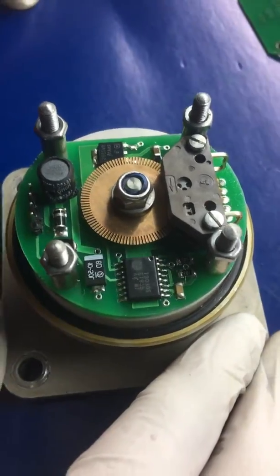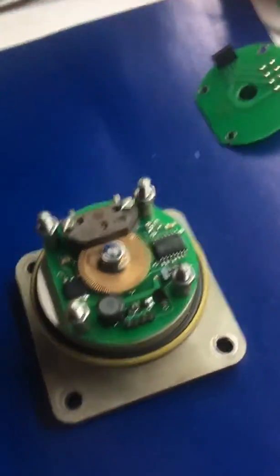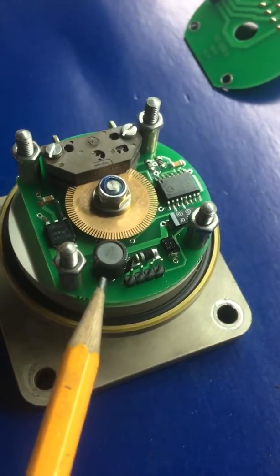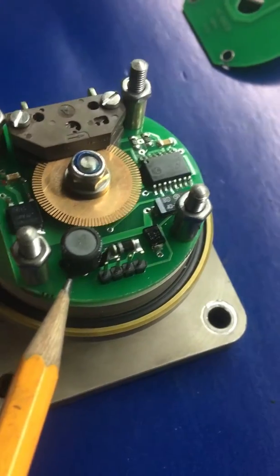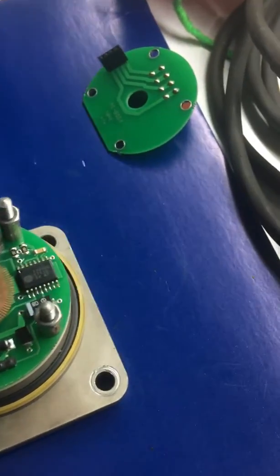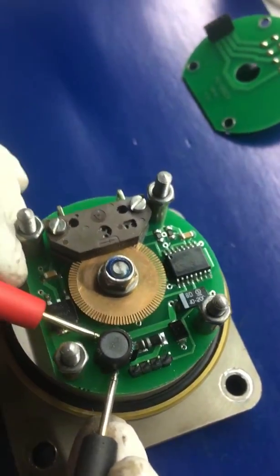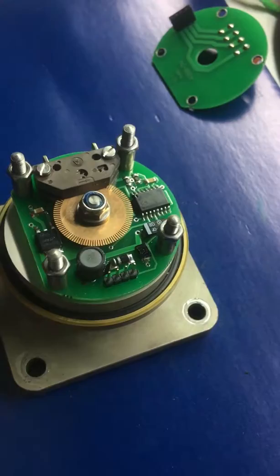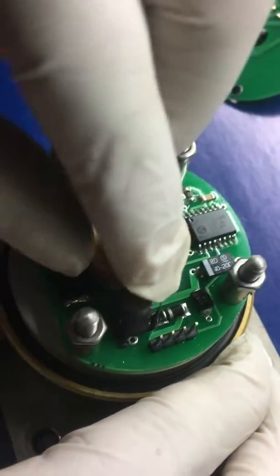This is the electronic part of the ATP sensors. Commonly, the items that are found to be defective is the coil here. I will try to test if the pins are broken. Right now we have found that a pin — the second pin — is broken. We will try to move it, and as you can see, it is broken.